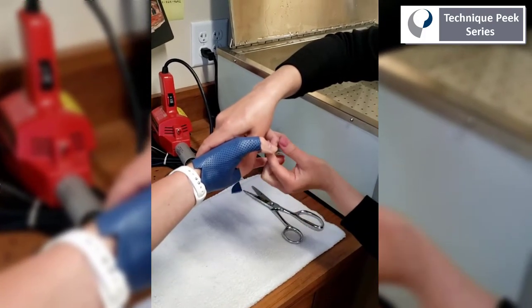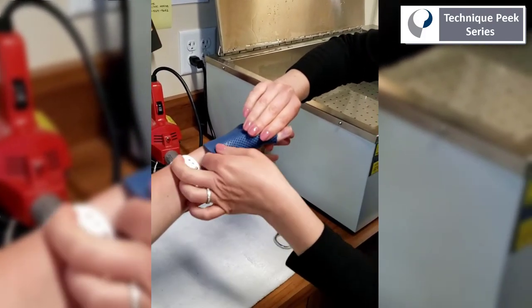Once the material is hard, we can slip the splint off and trim off the excess.